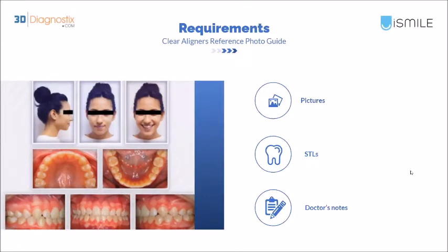To begin with, what are the requirements for any aligner's case? We need the pictures. They are called orthodontic pictures. We need 8 pictures, 3 extraorals, and 5 intraorals. We need the doctor's notes or the chief complaint to know exactly what we're going to do with the case. And of course, the STLs, what we're going to work with.